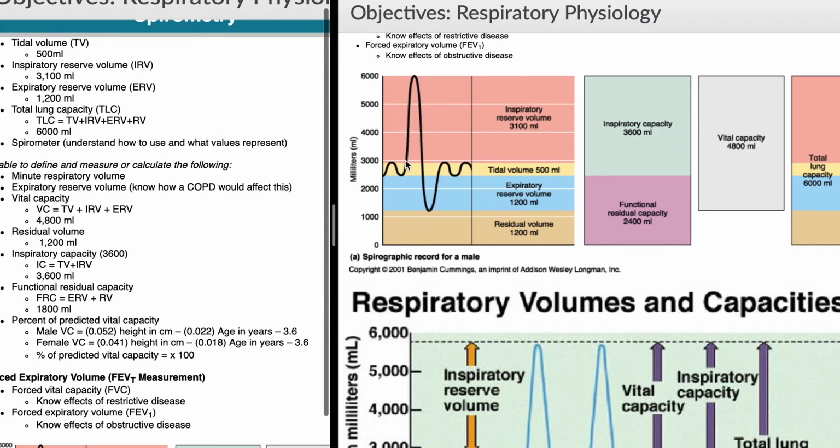In practice, this is actually pretty important because the way a spirometer works is that you instruct somebody to do something like take a big breath in and you measure it. If you keep the spirometer on their mouth when they breathe out, you may double the measurement. You might actually get double what the actual inspiratory reserve would be. Now, if you're using a digital one, usually they can sense the direction of airflow, so you can still get the right number even if you use it carelessly. But that's the important part. And in this class, the important part is the definitional understanding of this.